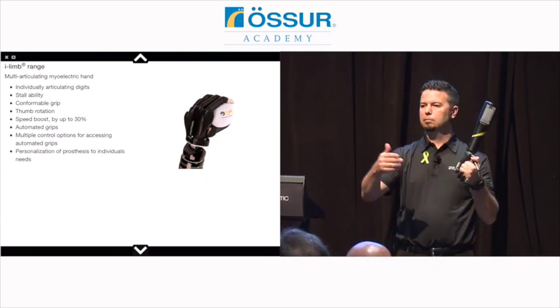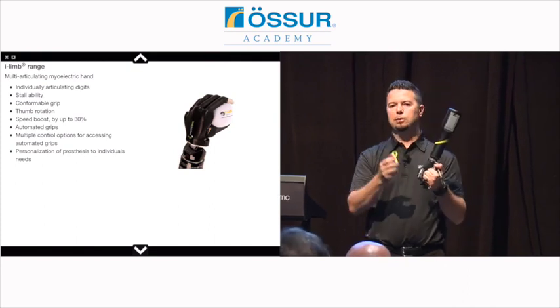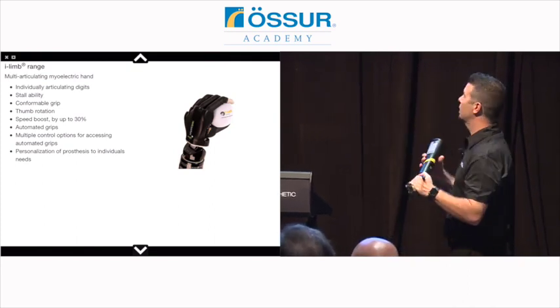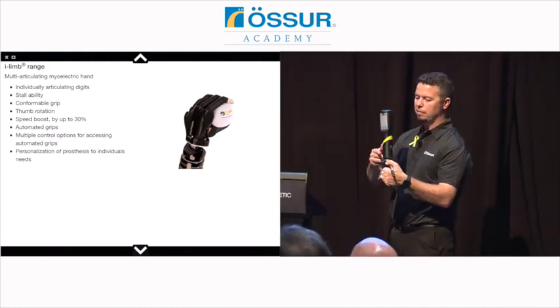So as the fingers hit a coffee cup or my hand, you're shaking somebody's hand, it's going to stop moving and take the shape of that object. So that's kind of cool. And that's just baked into it. There's nothing you have to do or set up. It's just a part of having a motor in each finger.